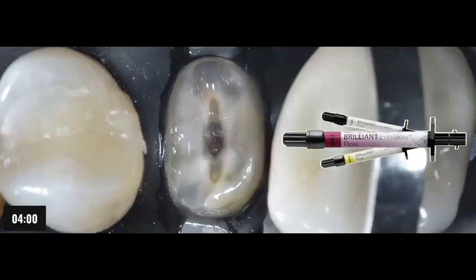And now you can see this 4-minute mark right here on my lower left side of the screen. Now is my waiting time. And this 4-minute waiting time allows my hybrid layer to mature. I want to make sure that I don't put any composite layers on top of this. I don't want to put any curing light on top of this.